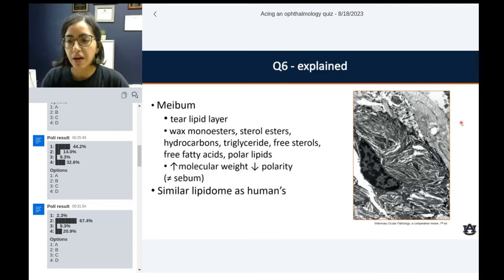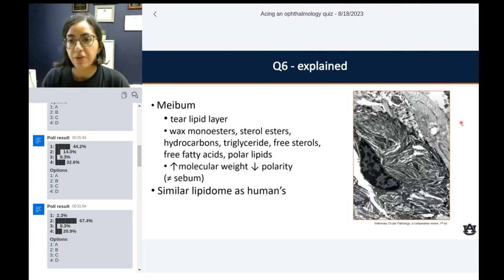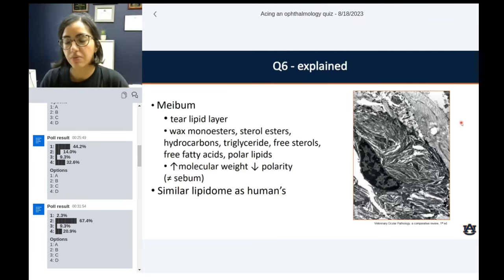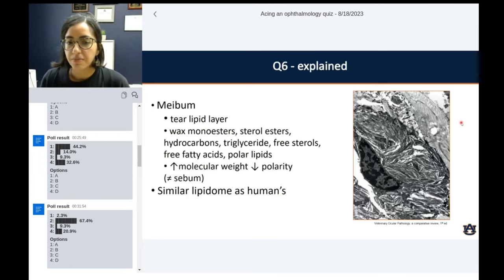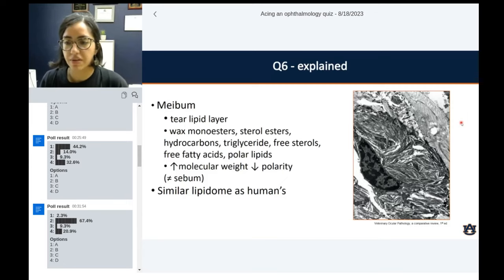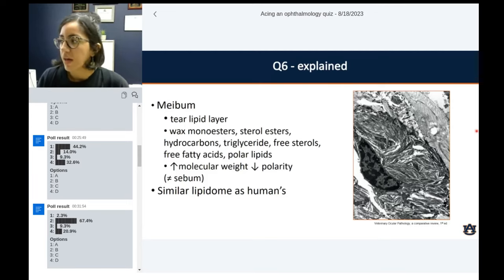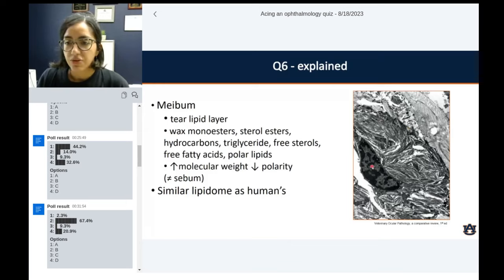There can be some comparisons, especially with diseases that affect the meibomian glands. This is a transmission electron microscopy showing how those crystalloid structures look at higher magnification. This is the nucleus of that cell, and all of these guys are the linear components — supposed to be complex phospholipids, membrane rests, and lipidic content.